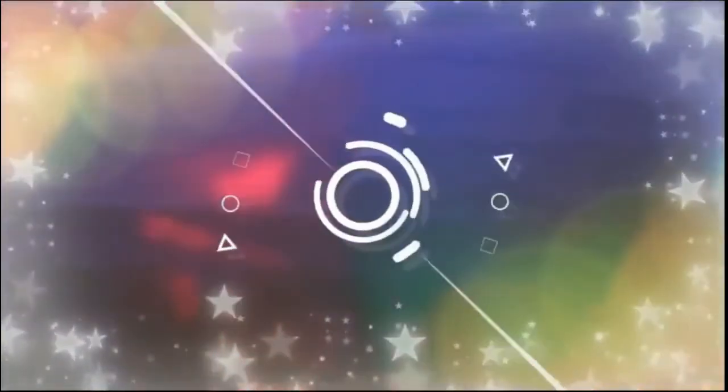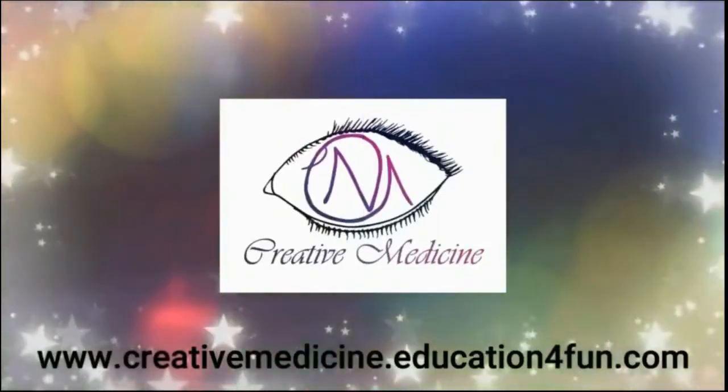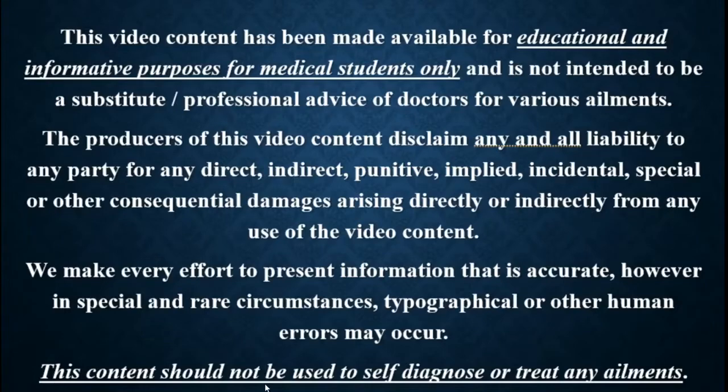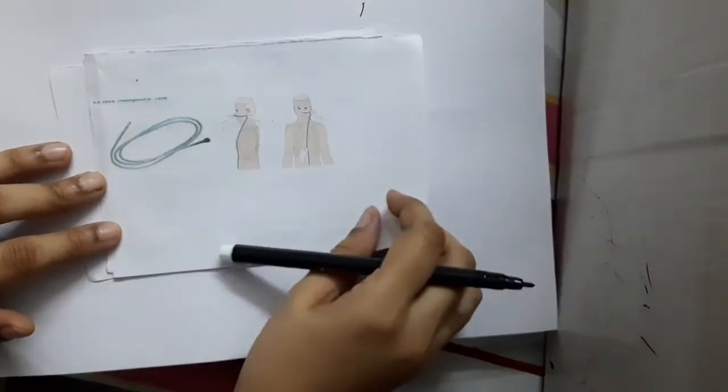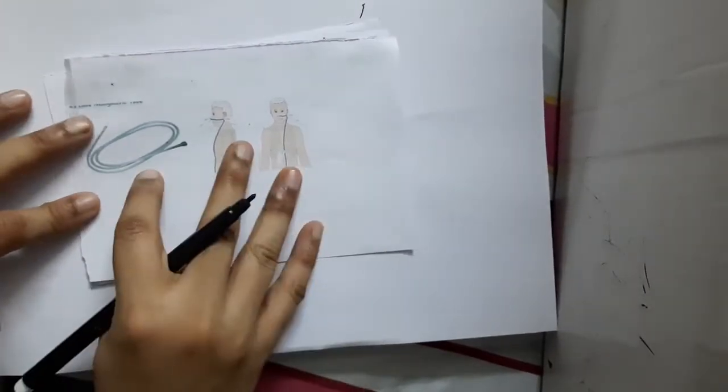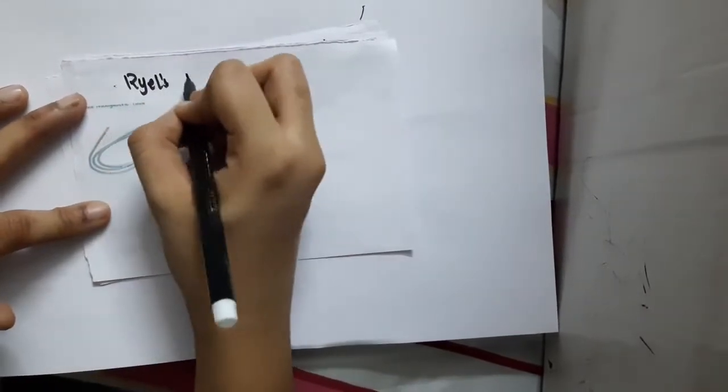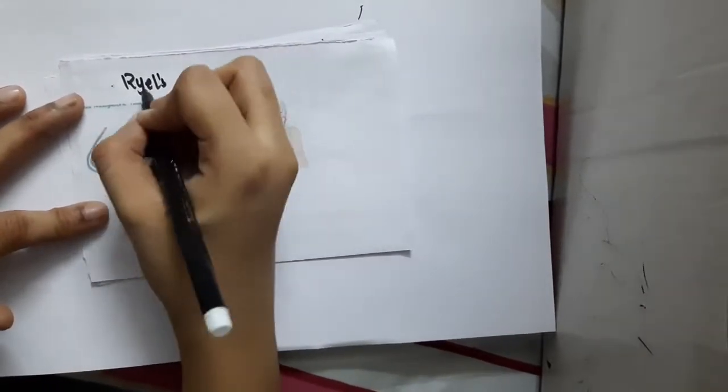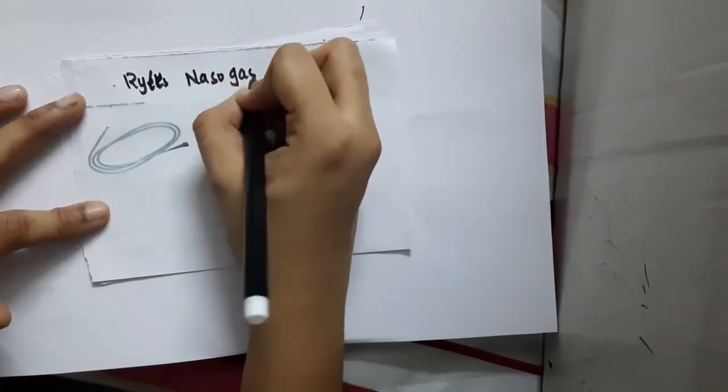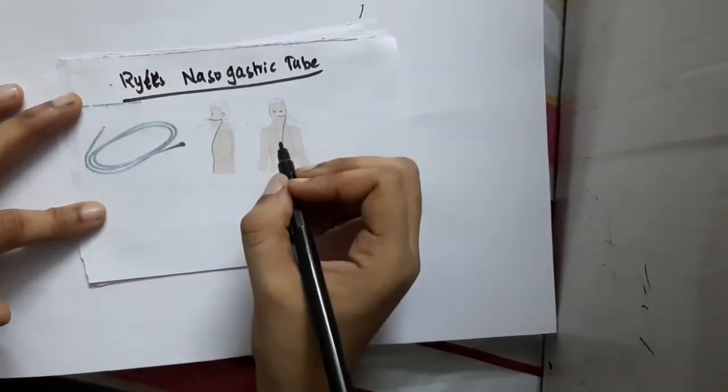Hello friends, welcome to Creative Medicine. In this lecture, we will learn about this instrument. Identify this instrument - this is a Ryle's tube, a Ryle's nasogastric tube. How are you going to measure it?